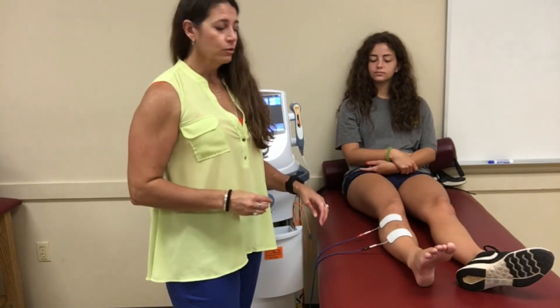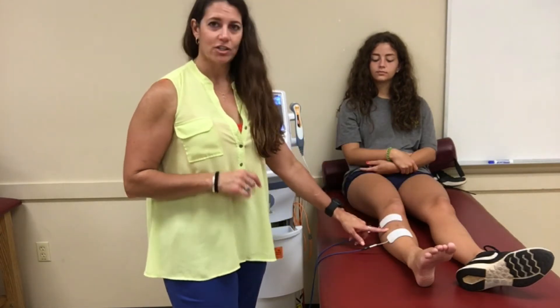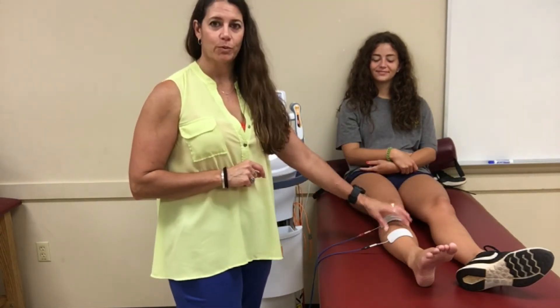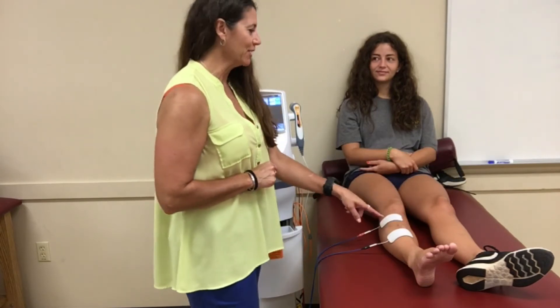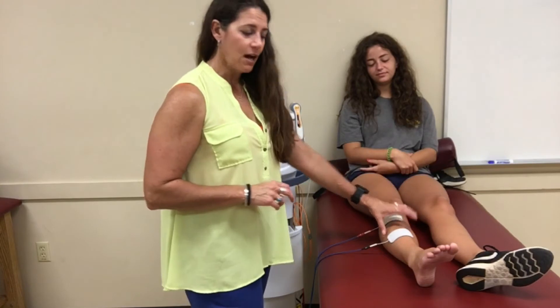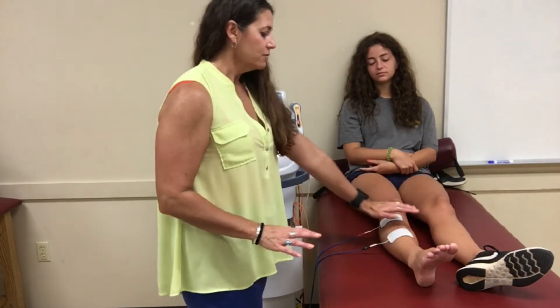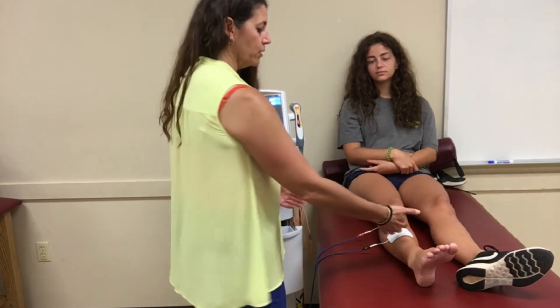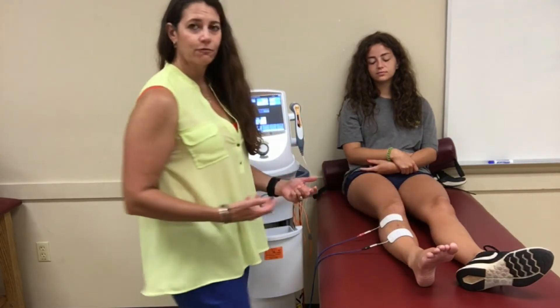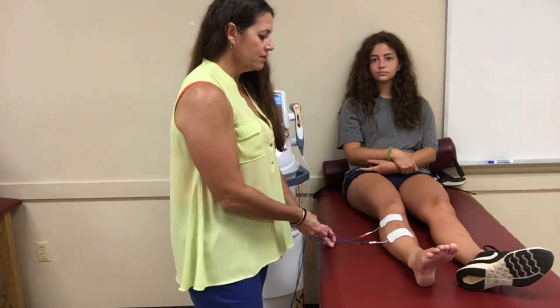Now we're going to demonstrate how you actually perform High Volt for wound management. We're going to pretend these scars that Meredith has are an open wound — which, by the way, I would not be putting my finger in if they were. You can place a bio-occlusive or something over the top so it's not just open, because the point isn't to treat the outer surface — it's to help with healing from the inside out.